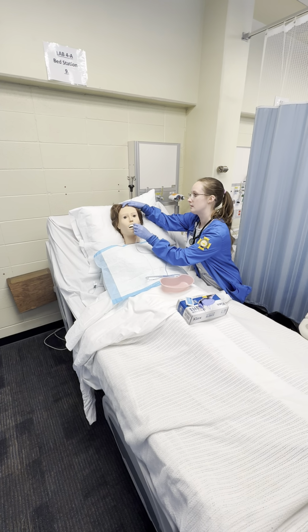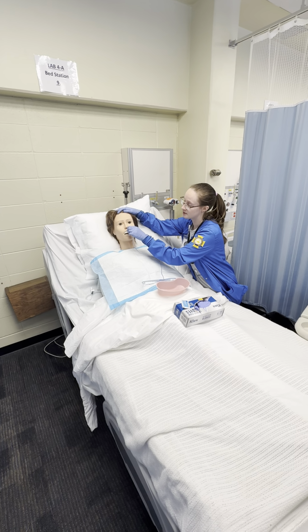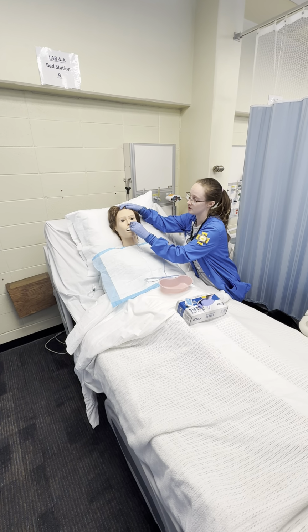and I'm just going to gently insert the tube with no excessive force. During this time, I'm also checking and monitoring my patient for any signs of distress, any kind of aspiration or problems. If there were, we would discontinue the procedure and remove the tube.